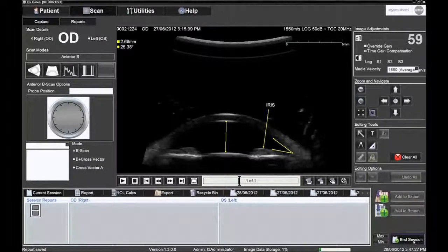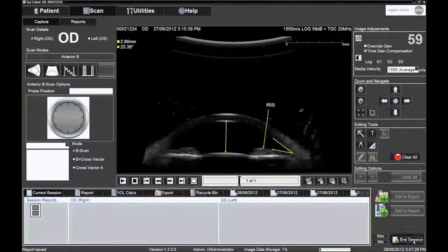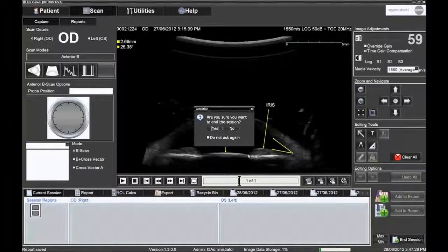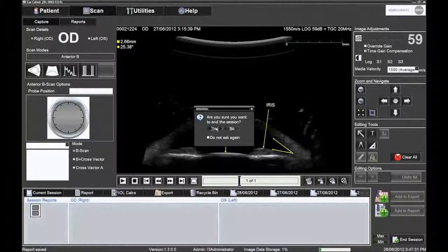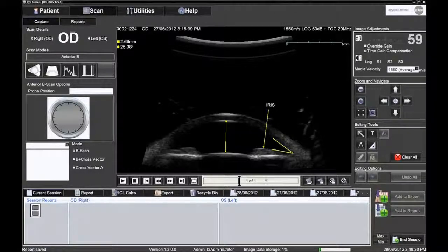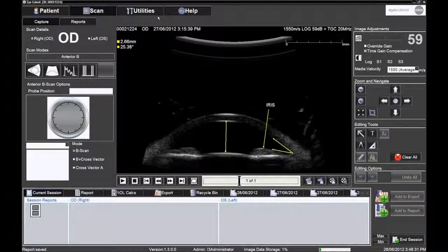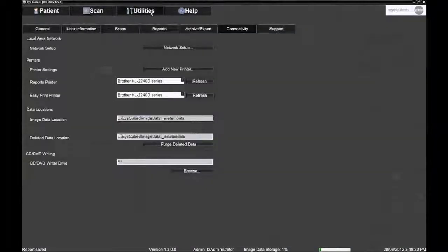The print job is sent to the default printer that has been pre-selected in the report printed drop-down box, located within Utilities under the Connectivity tab.